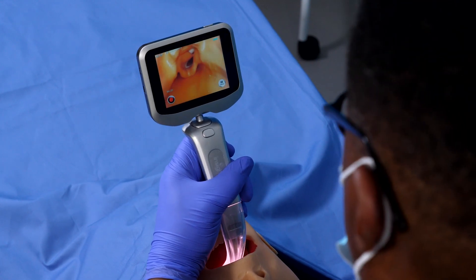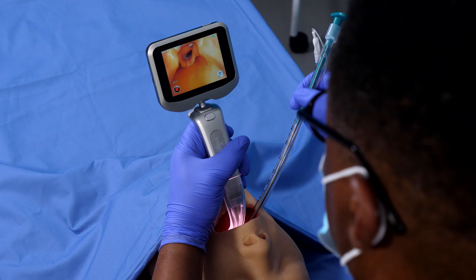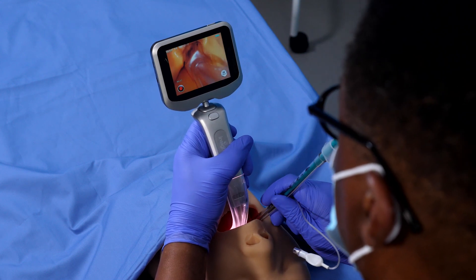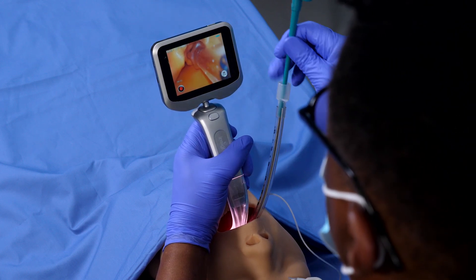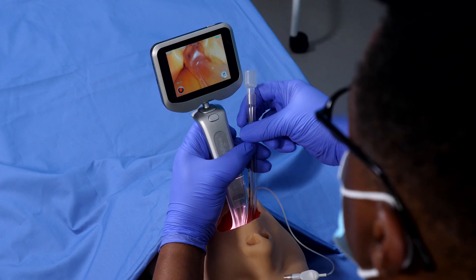Insert the endotracheal tube loaded with the preformed stylet alongside the blade. Once the tube is past the glottis, remove the stylet and insert the tube into the appropriate depth of the patient's airway.